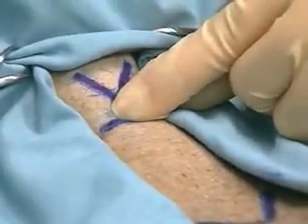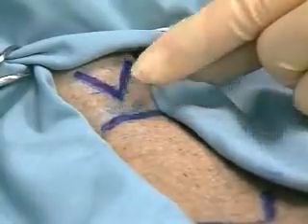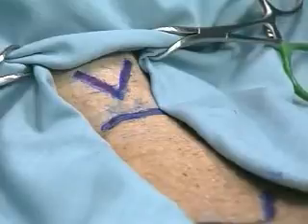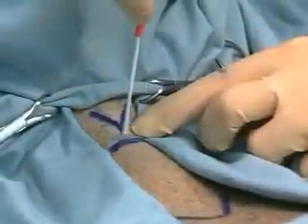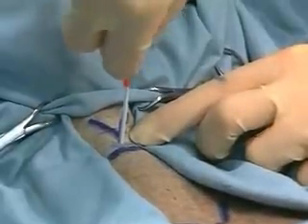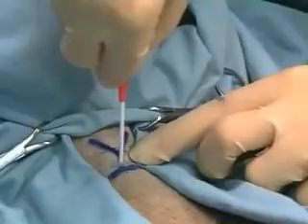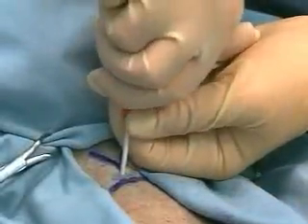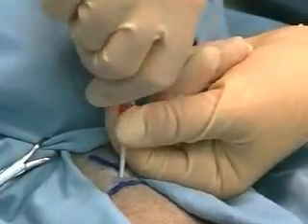Attach a 5 milliliter syringe to a 12 to 14 gauge angiocatheter and puncture the skin in the midline over the cricothyroid membrane. Direct the catheter inferiorly at 45 degrees to the skin. Gently advance the catheter while aspirating. Stop once air is aspirated, which confirms position within the tracheal lumen. Advance the catheter over the needle, down the distal trachea, and withdraw the needle.